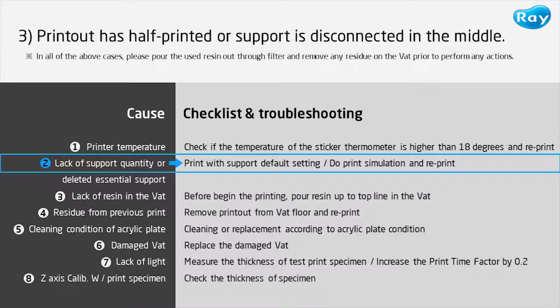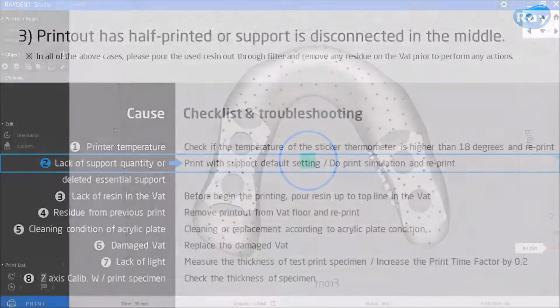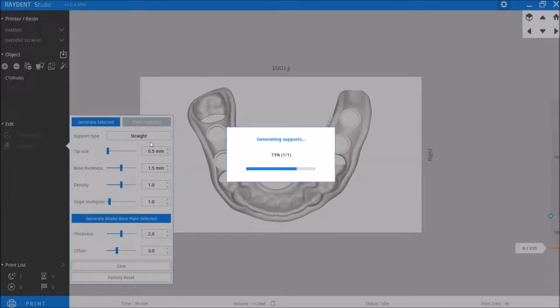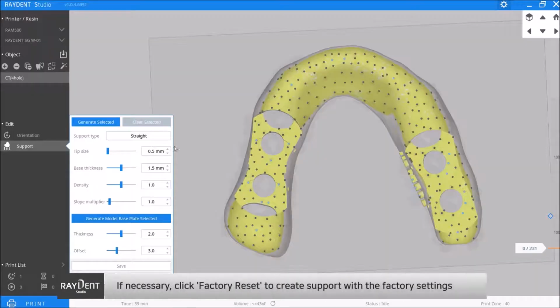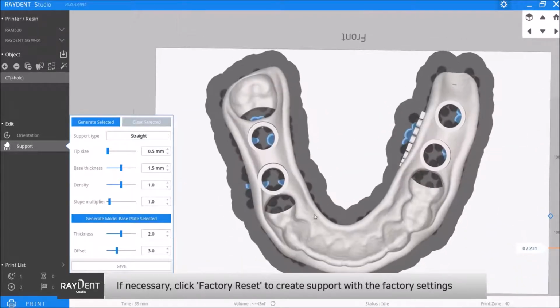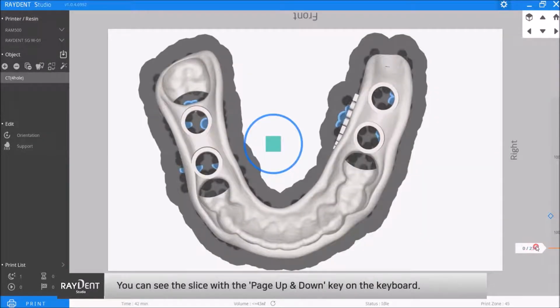The second cause is either a lack of support quantity or deleted essential support on the lowest spot. Go to Support, set the density to the default value 1.0, generate and try to reprint. If you're not sure all the slices have been supported, you can examine with the print simulation bar on the right.